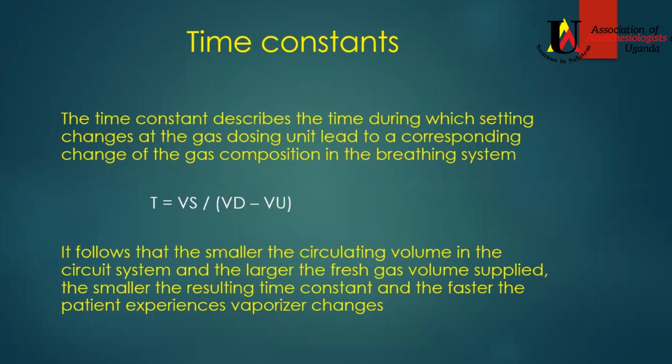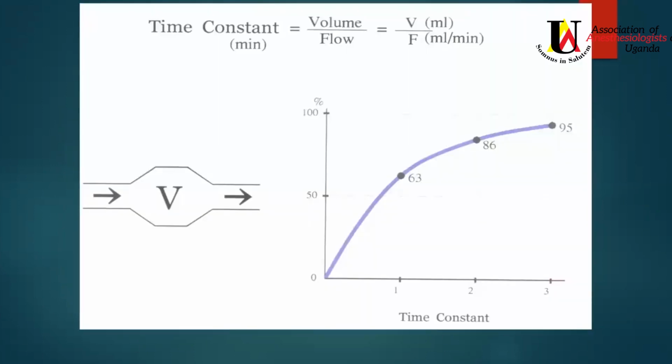However, if you are running low flows through this circuit, it is going to take quite a bit of time before whatever you've changed at the vaporizer is effected in the patient. Okay, and this has to be in your mind whenever you're running low flow anesthesia. So basically that is it.